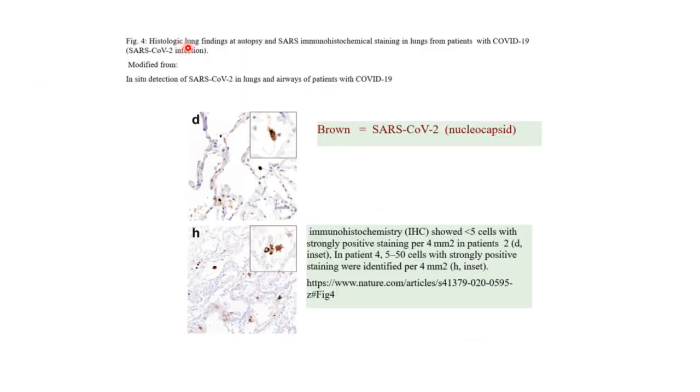So this is a histologic lung finding at autopsy. So this is from a patient tissue section, and there is detection of SARS-CoV-2 in lungs and airways of patients with COVID-19. Brown equals SARS-CoV-2 nucleocapsid. So there it is, SARS-CoV-2 antigen present.